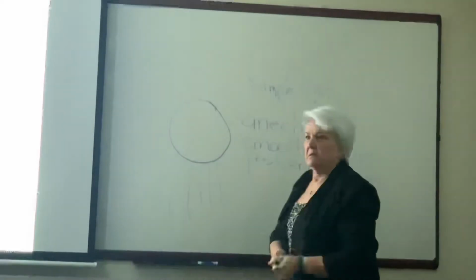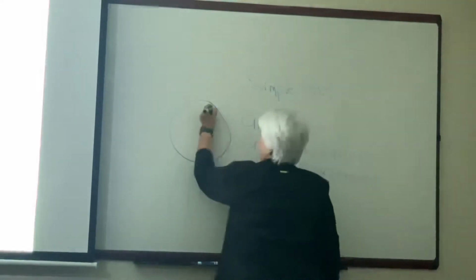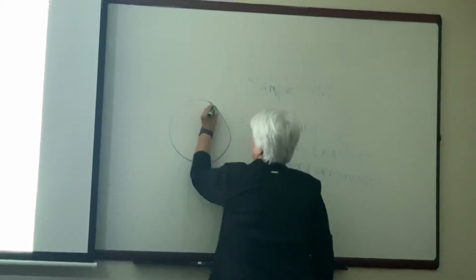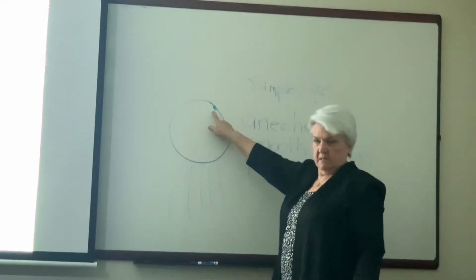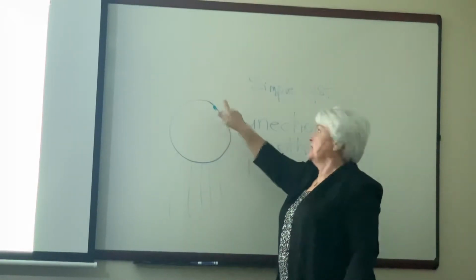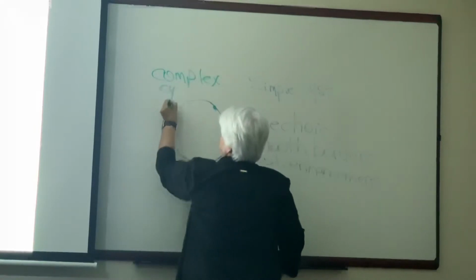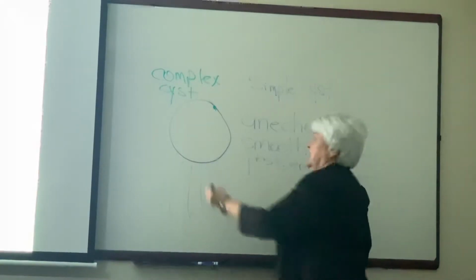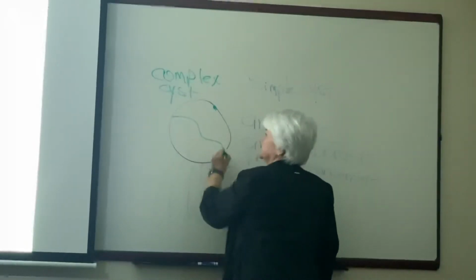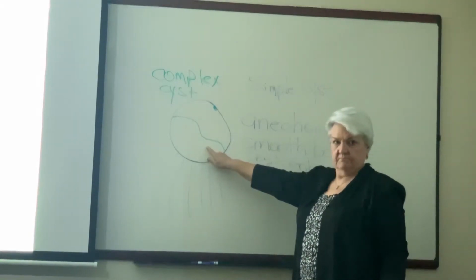Okay. Now, I have a simple cyst. But now I have an echogenic focus. Echogenic foci throw it into a complex cyst. Okay? If I have a septation in it, that's also a complex cyst. Okay?